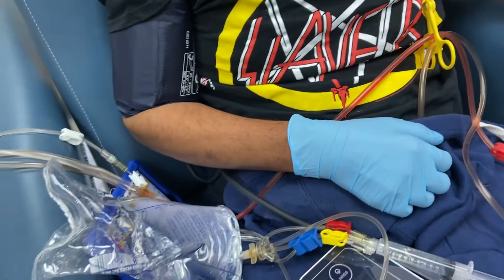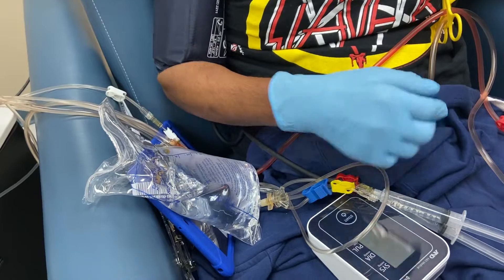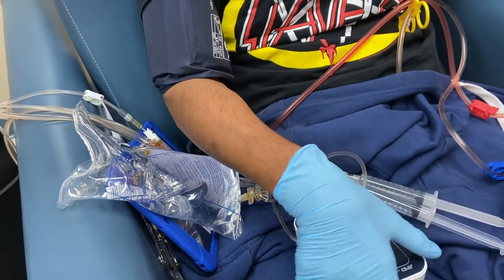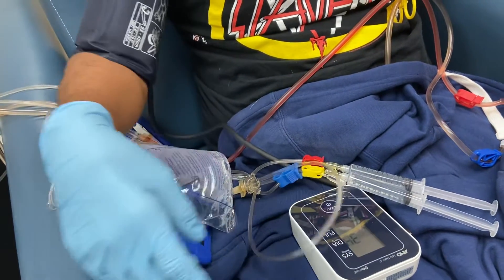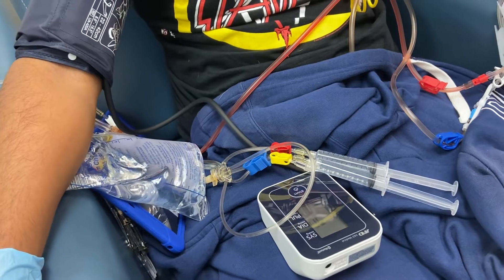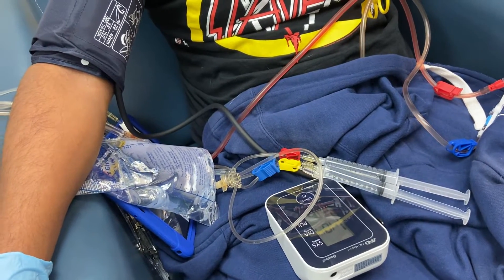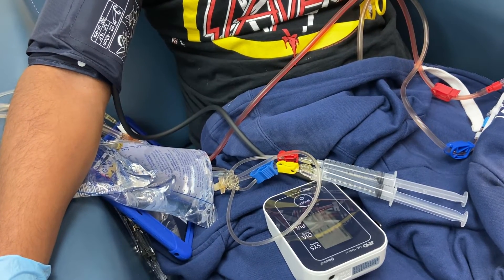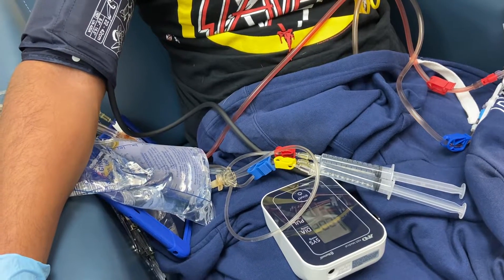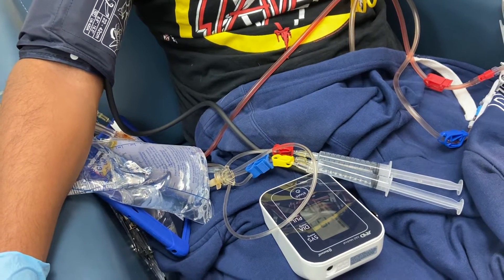Now you will take your blood pressure before disconnecting yourself from the machine. The purpose of taking the blood pressure before disconnecting is so you can infuse more saline just in case the blood pressure is low.